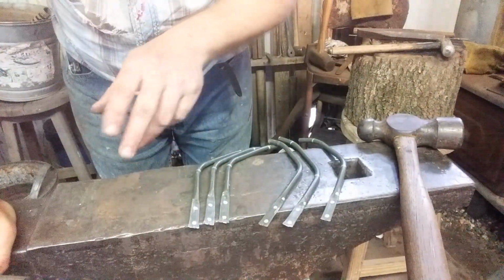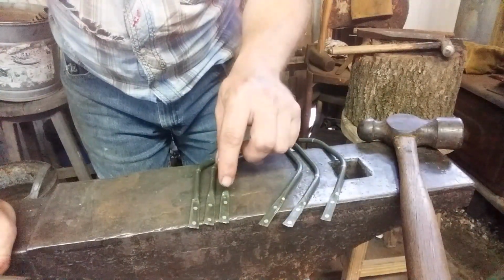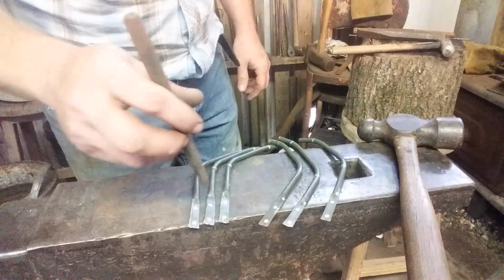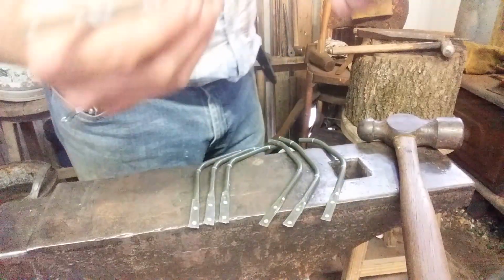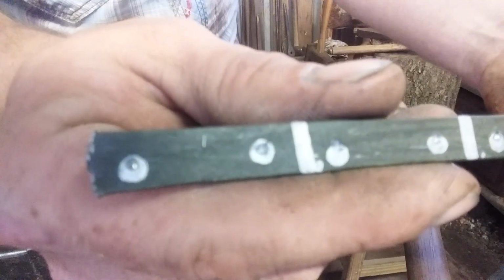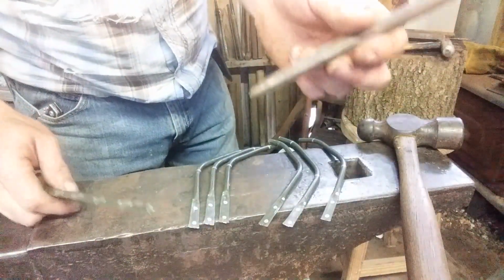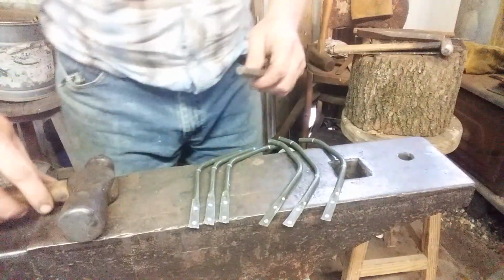Now before trying to drill a hole in anything, first you have to mark the area, of course. And your drill bit's not going to want to stay centered without something to orient it. So I'm going to use a center punch to create a little divot in the center of each one of these dots. The same as I did with the little link pieces. I don't know if you can see the divots. And when you punch the divot, if the mark is off center, try to center it by eye or measure before you punch the divot, because that's where your hole is going to be centered. So let's go ahead and center punch these.